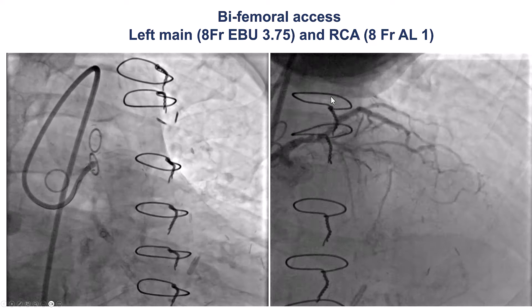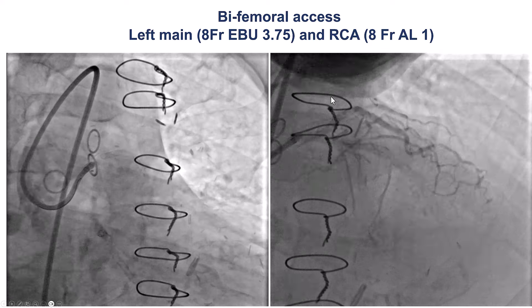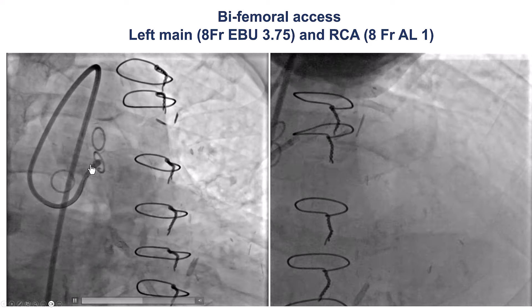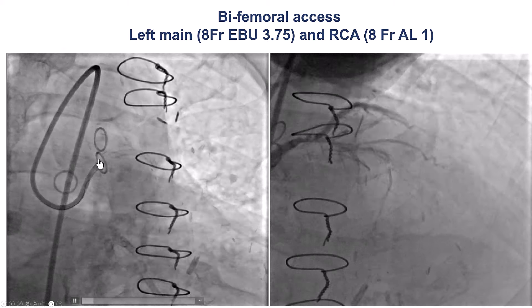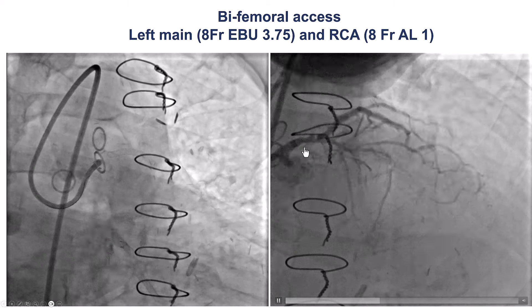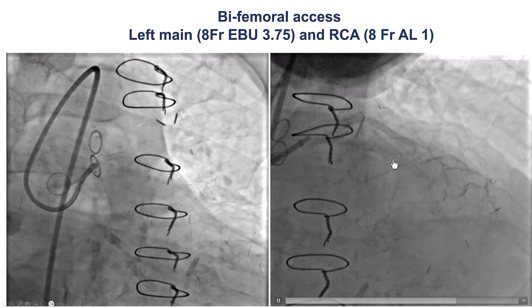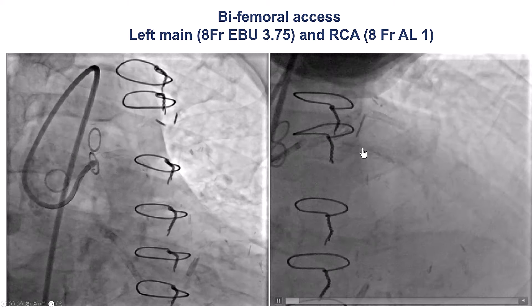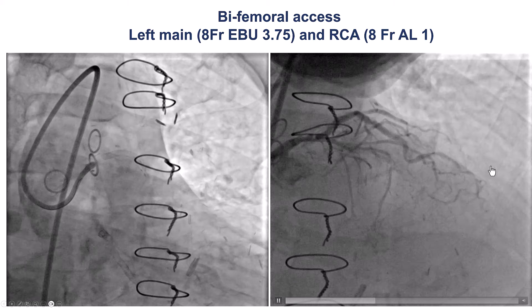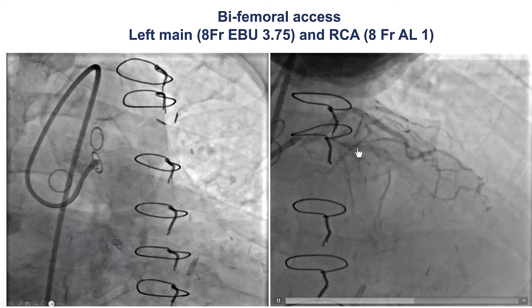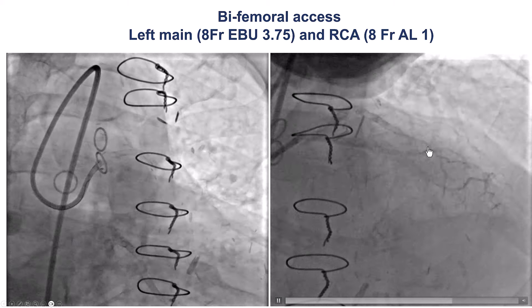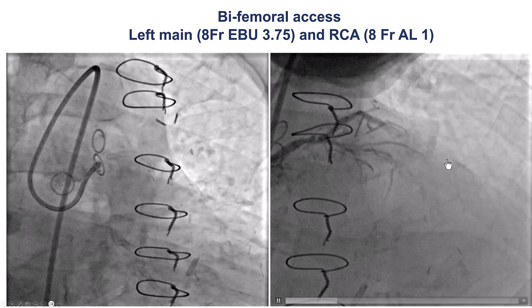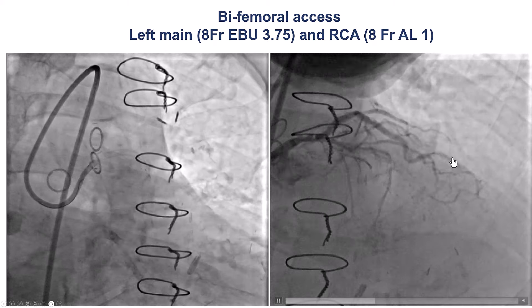The patient came back for a repeat attempt. Once again, we have an occlusion of the saphenous vein graft to the LAD and a CTO of the mid-LAD. Pay attention to this diagonal branch — not huge, about 1.5 mm — that will become relevant, as we will discuss later on.